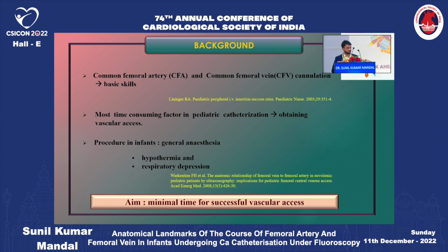The method we have for femoral vascular access is the anatomical method in relation to the femoral head, but what we can see here is that in infants the femoral head is not ossified. Also, the greater trochanter is not ossified. Another limitation is that external landmarks may not correspond to internal anatomy, especially in chubby children.